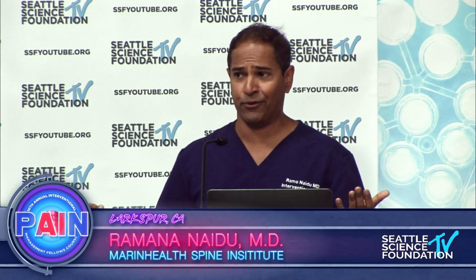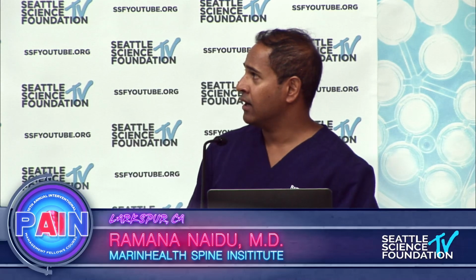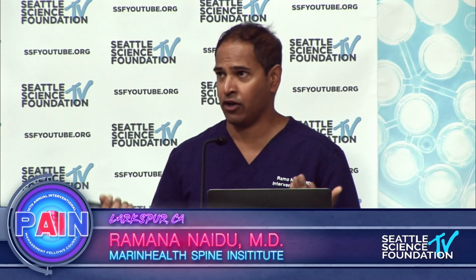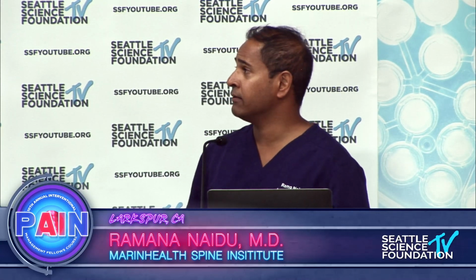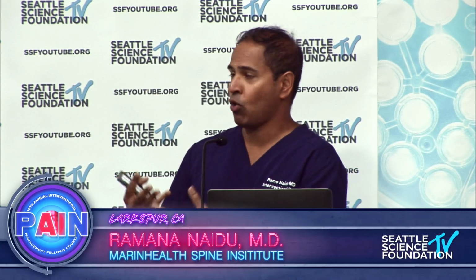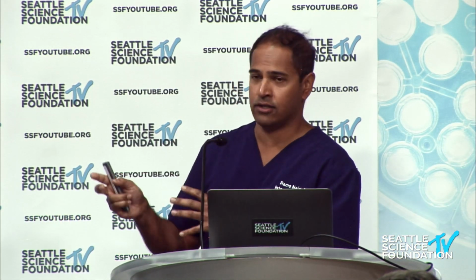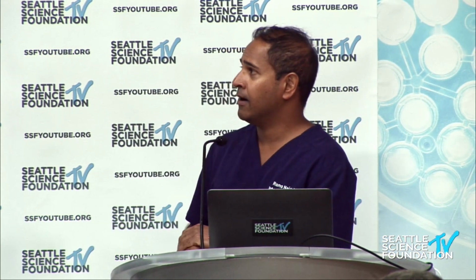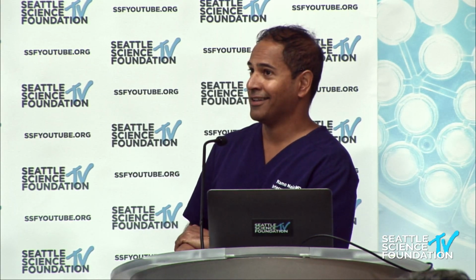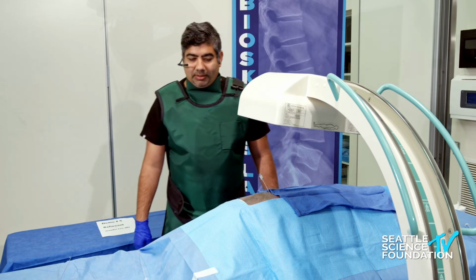There are so many people with peripheral neuropathy foot pain that if you can drop these two leads, you're not at risk of dural puncture when you're that far lateral, if that's what you're afraid of. I think we really need to do a better job of making that more normal, more standard. So I'd strongly encourage you to learn how to do the technique. It's not that hard. Really straightforward and easy to do, and it can really make a difference for patients getting off their medications.